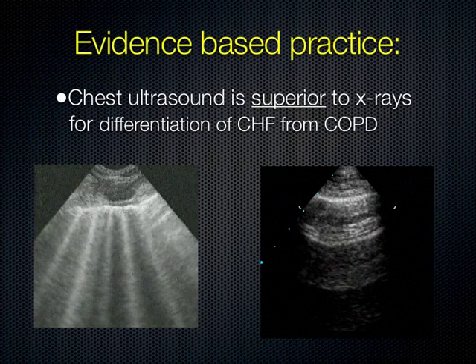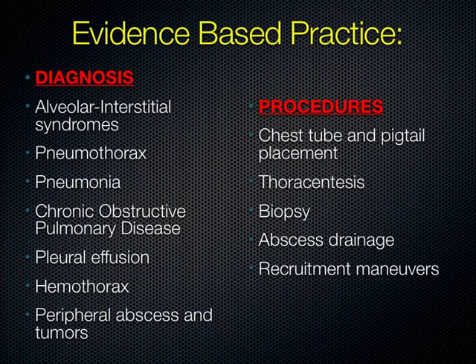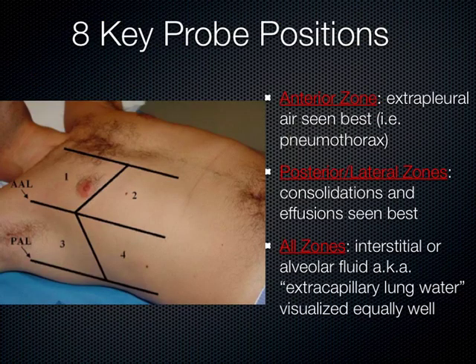We can see these on ultrasound, but we can also guide our procedures and our imaging during procedures to increase patient safety. All of this has been well worked out. There's some key probe positions which you'll be practicing today in your practical sessions, but it's also a good habit to get into to look at all eight key probe positions on the chest. There's four on each side.